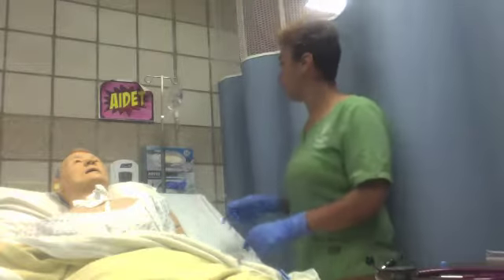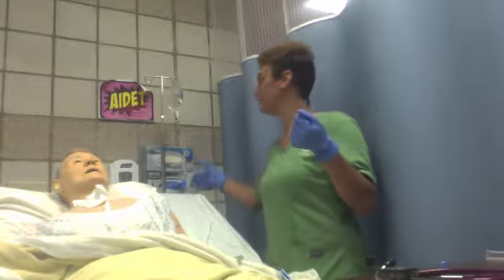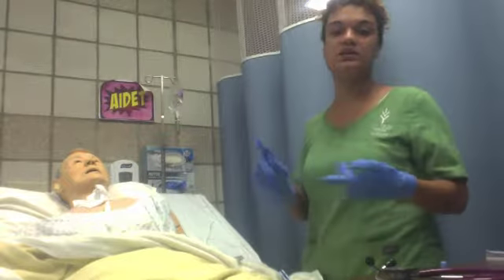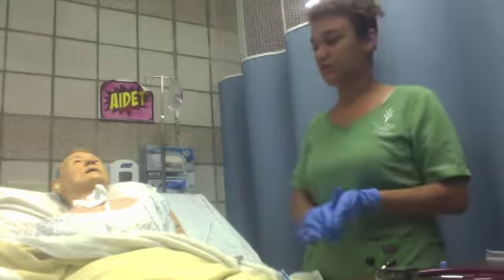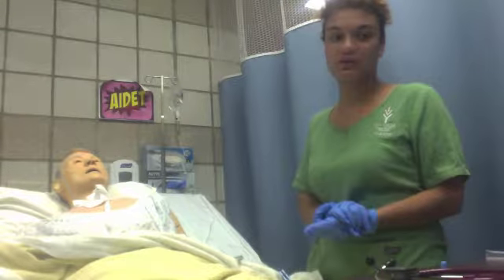All right. So then I'm going to be checking the monitor. When I'm looking at the monitor, I'm looking for the infusion rate. I'm looking at if there's any alarms. I'm looking at the flow. I'm checking all that with the computer.